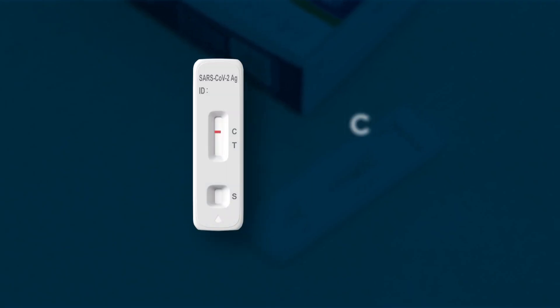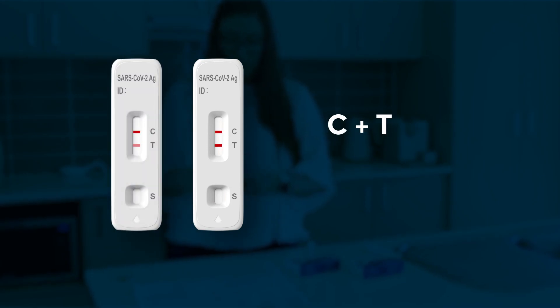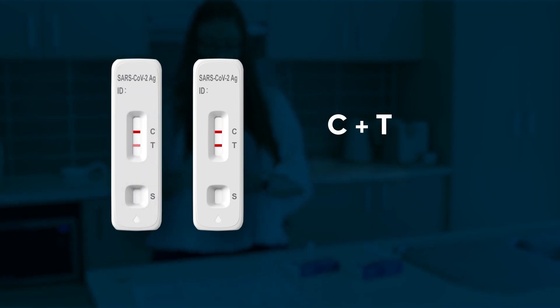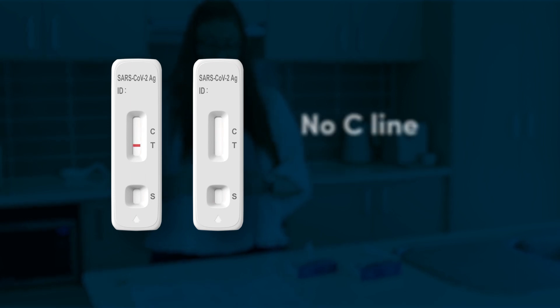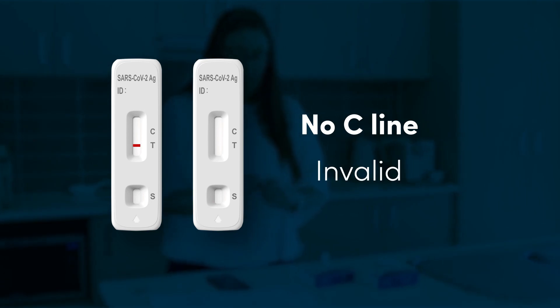A coloured line next to C and no coloured line next to T means your result is negative. Coloured lines next to C and T, including faint lines, mean your result is positive. If there is no coloured line next to C, your test is invalid. Try again with a new kit.